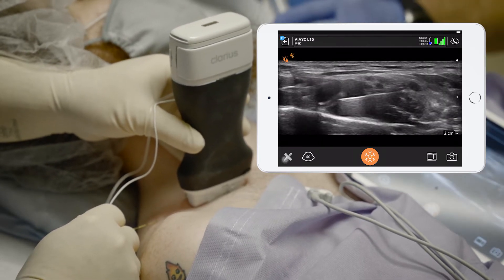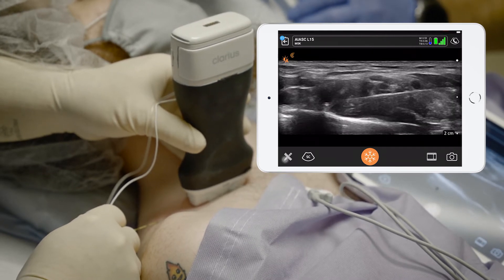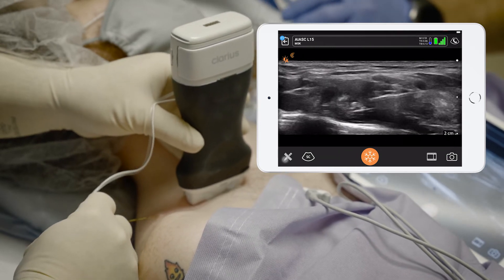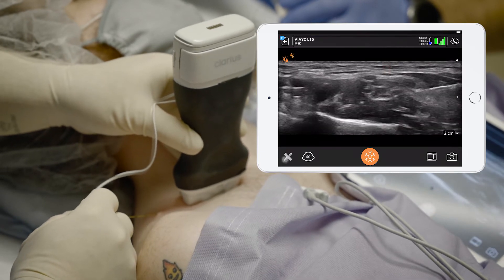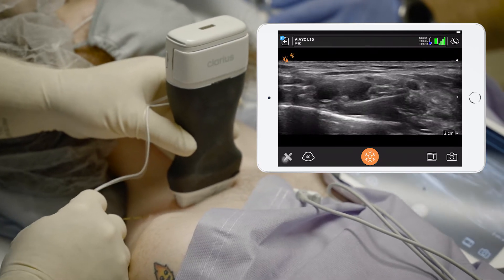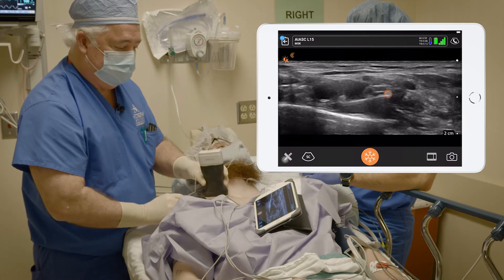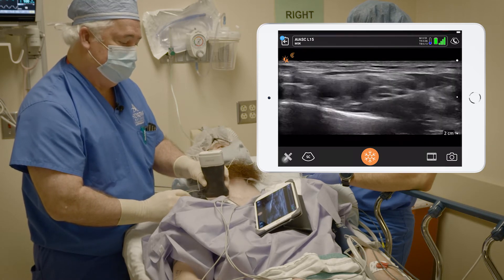Lifting everything up. That's fifteen. Five more here — aspiration's negative — one, two, three, four, five. Usually I get more of the plexus here, but since we're just doing the ulnar nerve transposition, I'm just going into the corner pocket and lifting the whole plexus up, letting the local go up between the artery and the plexus, and soaking the lower trunk to get that lower trunk.